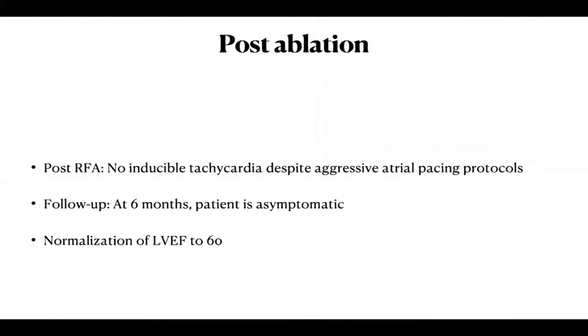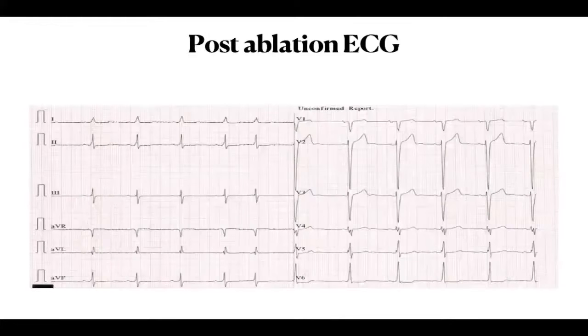Post RFA, there was no induced tachycardia despite aggressive atrial pacing protocols. The patient on follow-up of 6 months is asymptomatic. There is normalization of LVEF to 60%. This is the post-ablation ECG showing sinus rhythm, even at the end of 6 months.